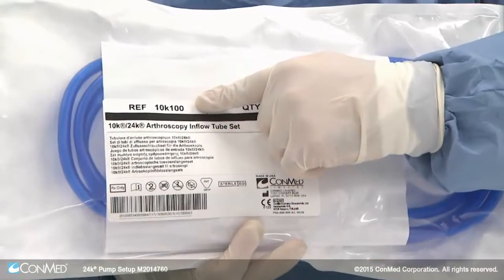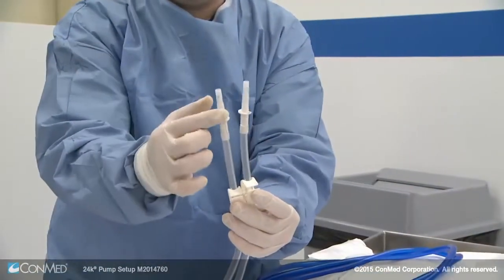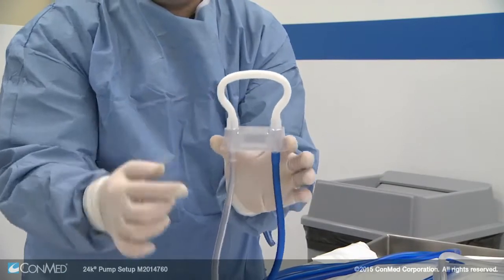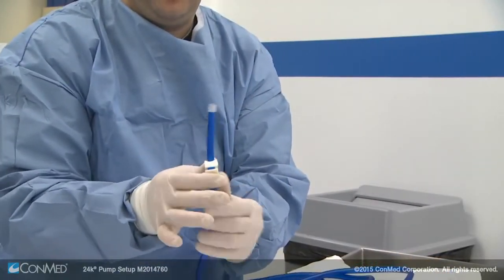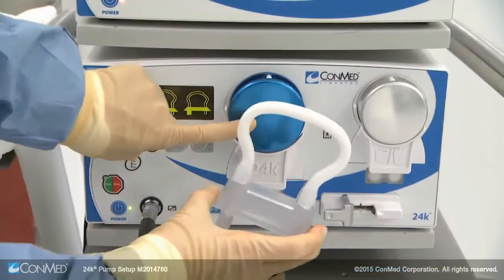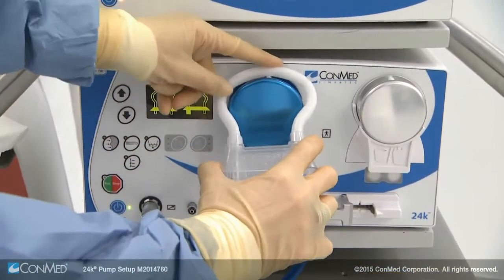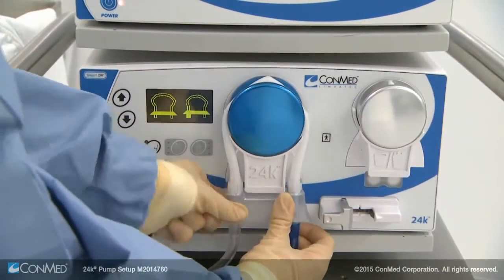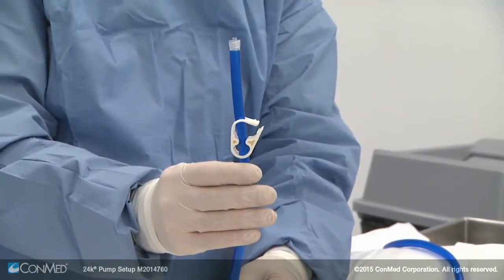To set up the 24K pump to run inflow only, open a package of 10K 100 tubing. This set includes two fluid bag spikes that lead to a cassette that holds a blue inflow line. At the end of the inflow line is a luer lock and a white fluid clamp. To install the cassette, bring the white tubing loop over the top of the blue rotor and pull down until it snaps into place. The display will change when properly installed.